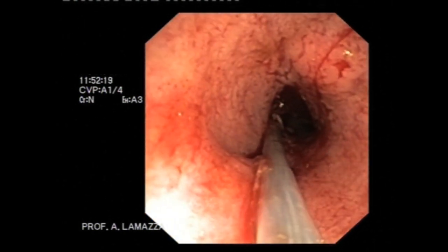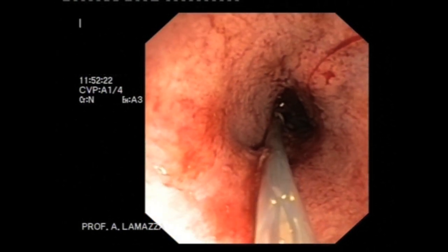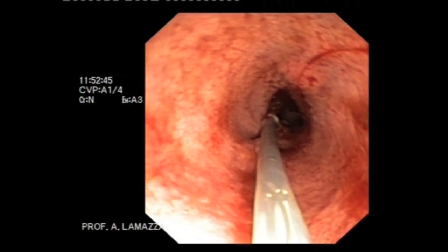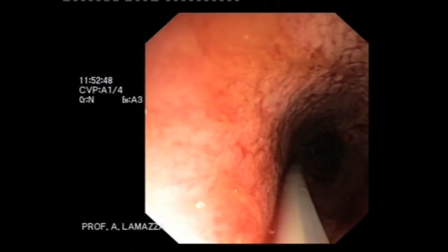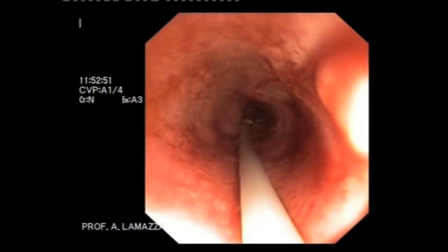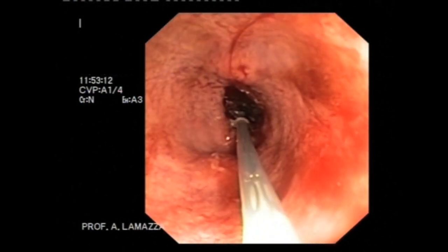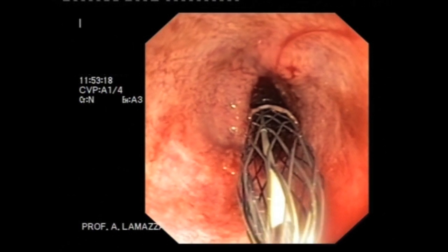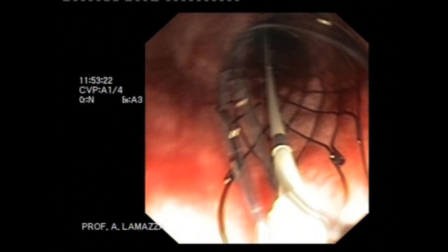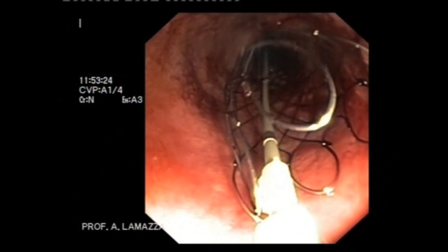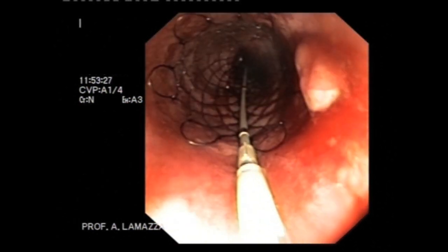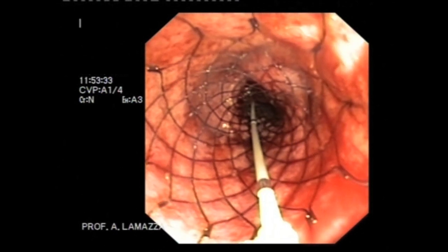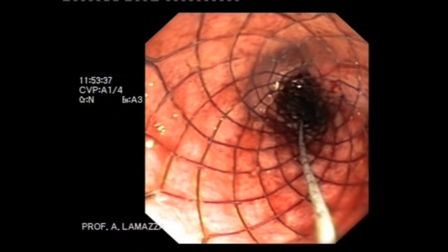The final position of the stent is confirmed radiologically, visualizing the stent itself. The outer plastic containing the stent is slowly removed; an assistant maintains the correct position of the stent apparatus. The stent is now in place and the guide wire is removed.